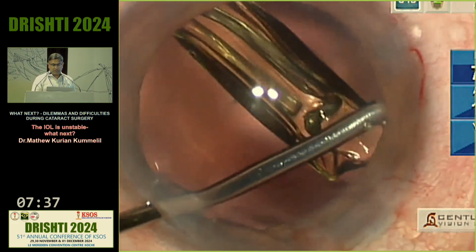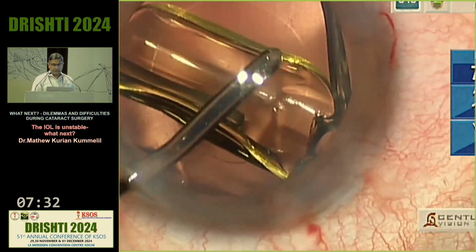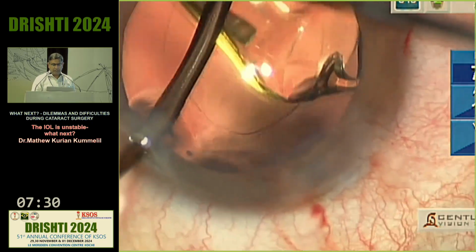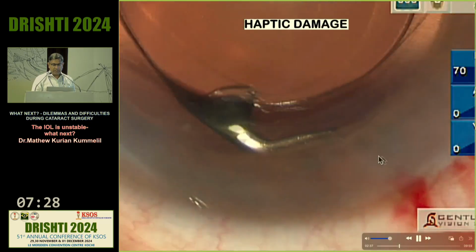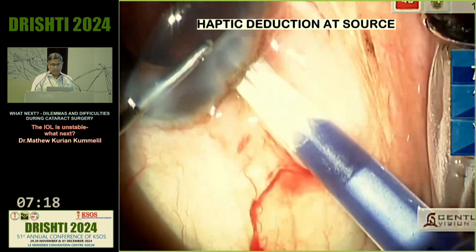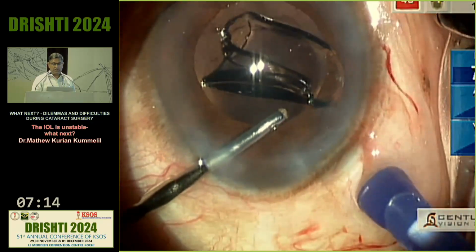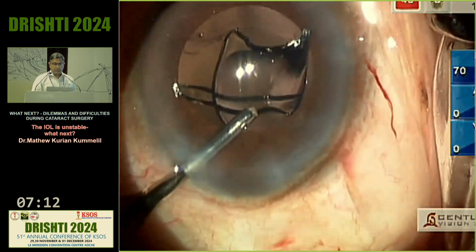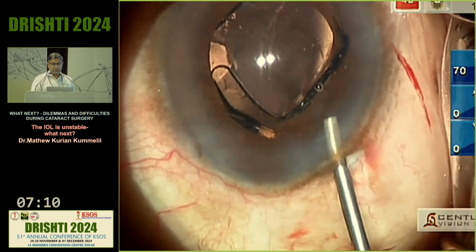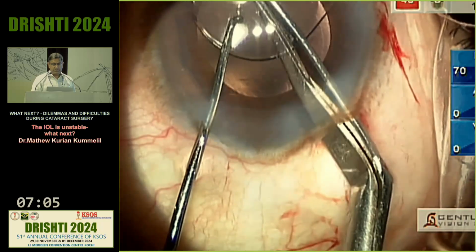A lot of force is required to deliver the lens into the bag, and at this stage, as the trailing haptic opens, you can see that there is a significant amount of trauma there, which I thought would be okay, but one week post-operatively that haptic was in the inferior angle with corneal edema, and needed to be replaced. This is very easy. It's not going to stabilize anyway. You have to exchange this.